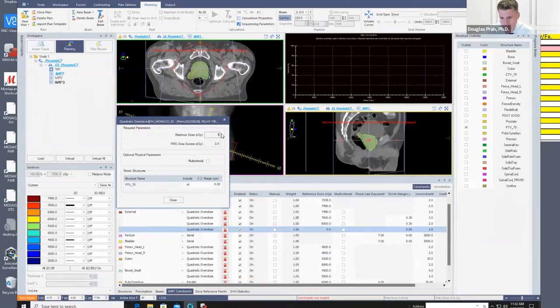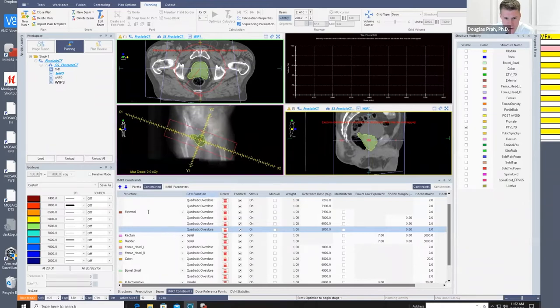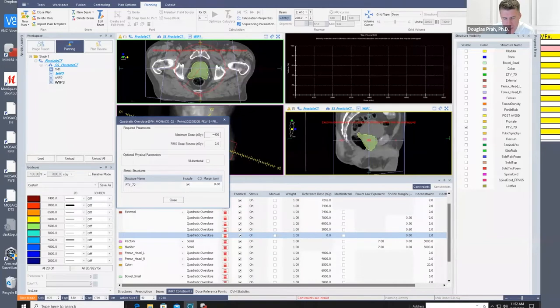Okay. So let's come in here and we'll do 5,000 and we'll double that now. So let's do 0.6. And we can do another one and we'll do 4,000. You can go with lower isodose lines. It just depends how tight you want those. In general, this is a pretty large patient. You're going to have some fingers coming out. So I don't usually go too far below around the 50% mark, that's usually where I stop. So let's do 0.9 here.